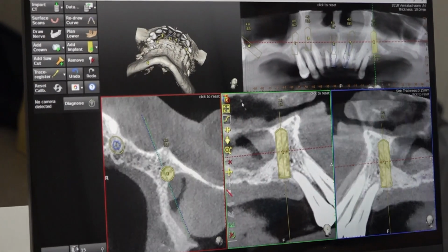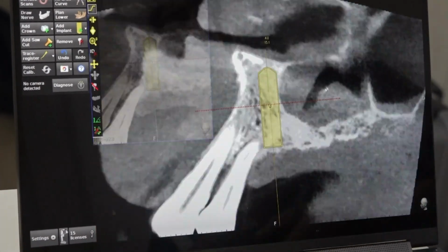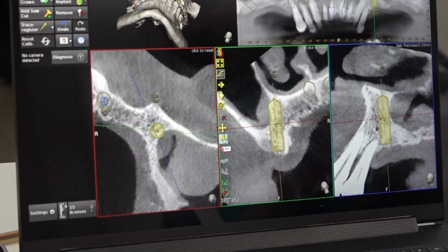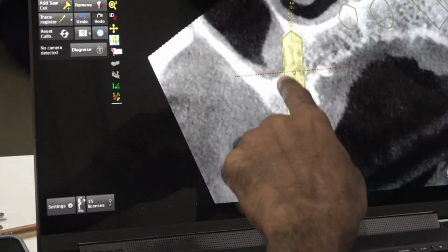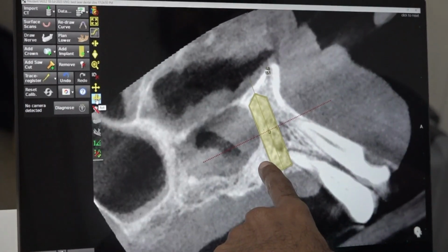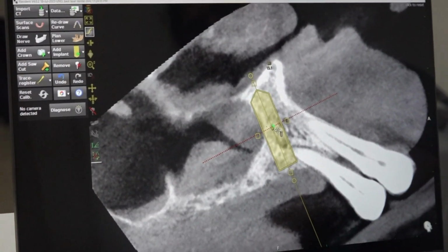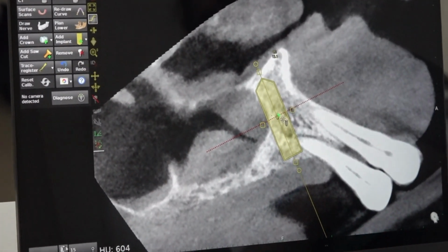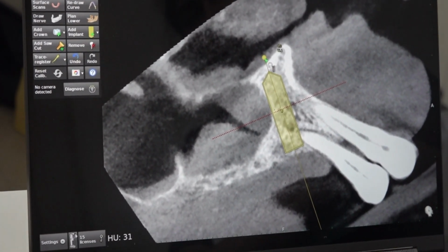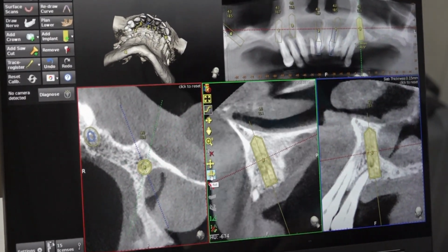Now just slightly angulating mesially. Now we'll see the 360. If you see here, this part is slightly in the sinus, the slightly distal part of the implant. But that is not a problem, because in the software it is a parallel implant, but the implant we are going to use is a tapered one. But you can even tilt this slightly anteriorly. Now it will be inside the bone.